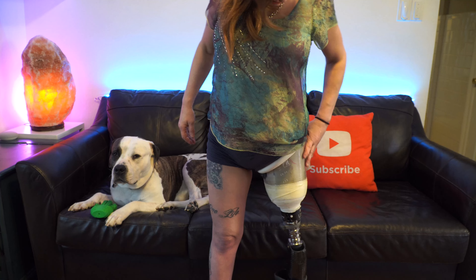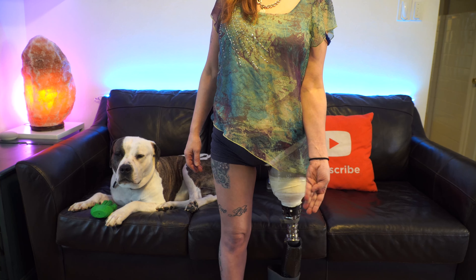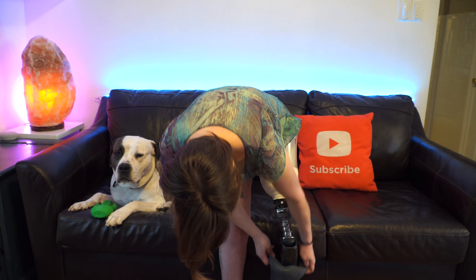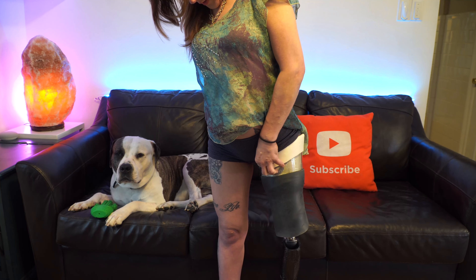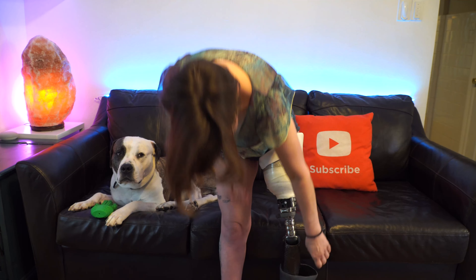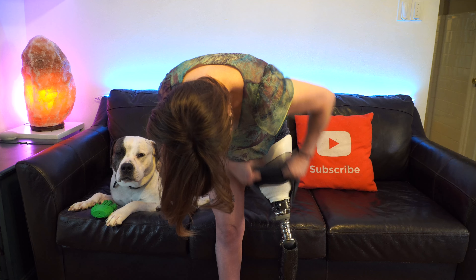First things first, I'm gonna take my shorts off. The way the system works, the sleeve rolls up all the way around my groin and my thigh. It's pretty hard to put on when I'm wearing pants because the pants kind of get all bunched up in there. In amputee land, there are always wardrobe considerations.